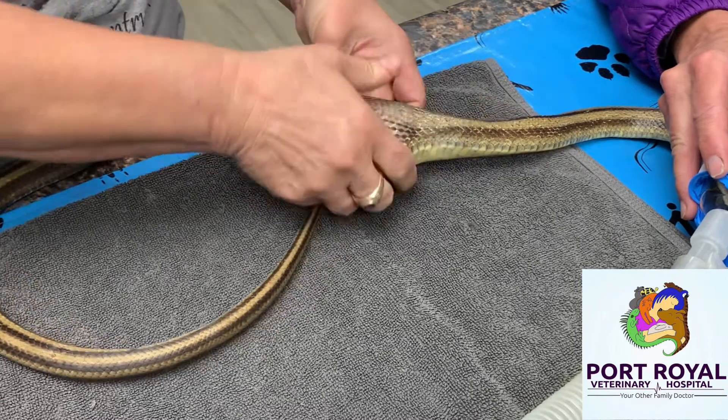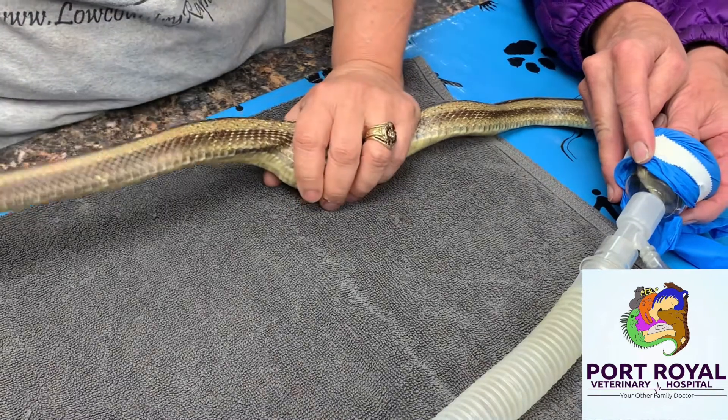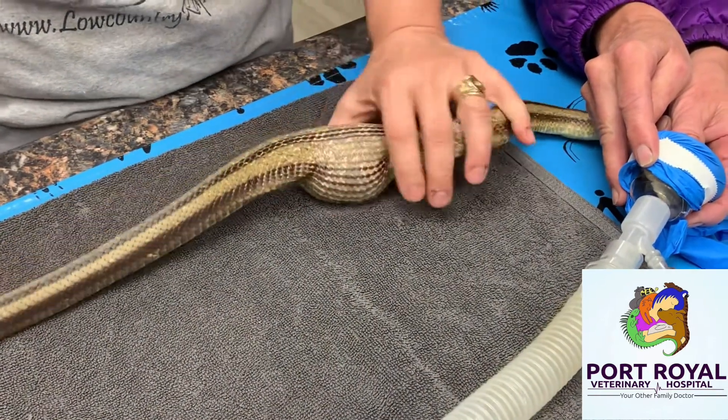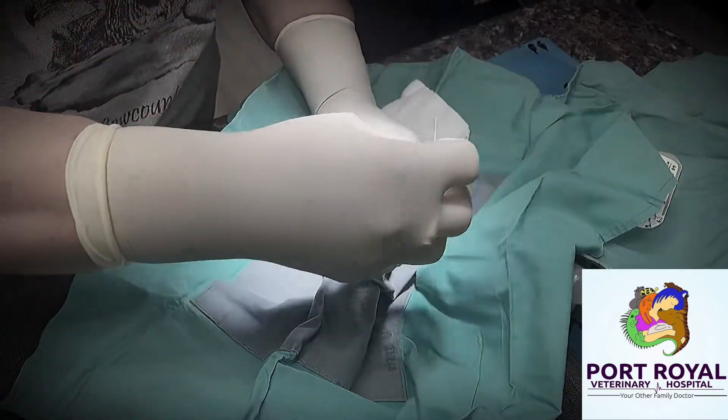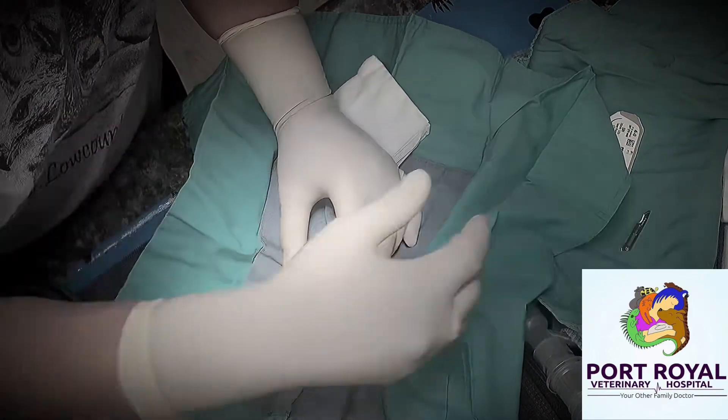After sedation, Dr. Mary Kay and Dr. Chavkin attempted to bring the egg back up through the esophagus, but it only moved partway. At that point, they made an incision through the skin and through the esophagus wall to remove it.